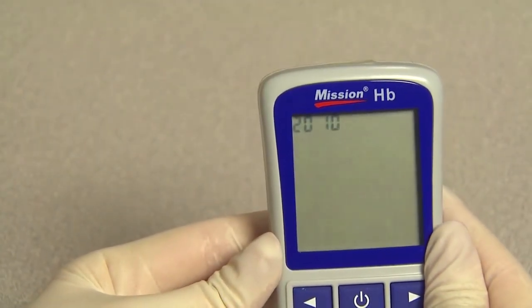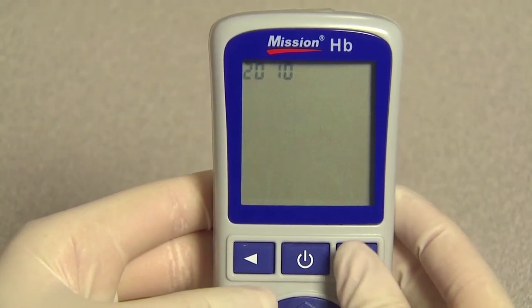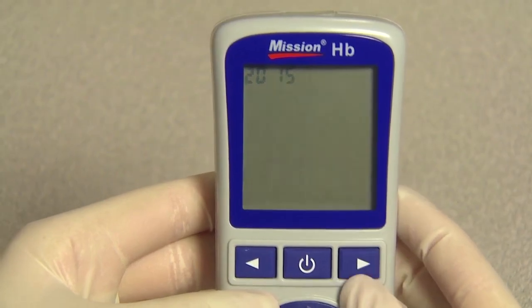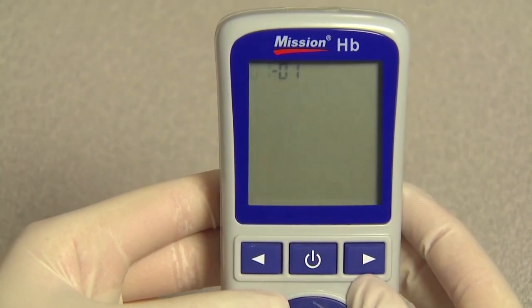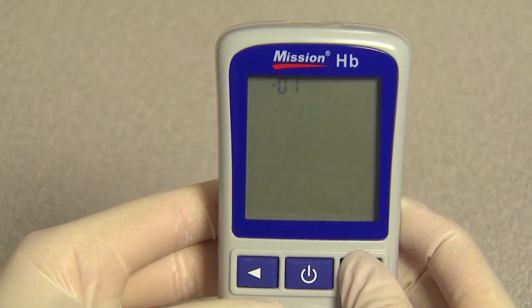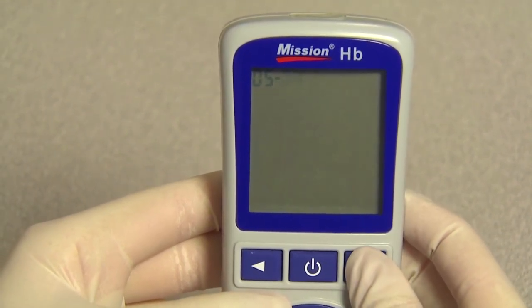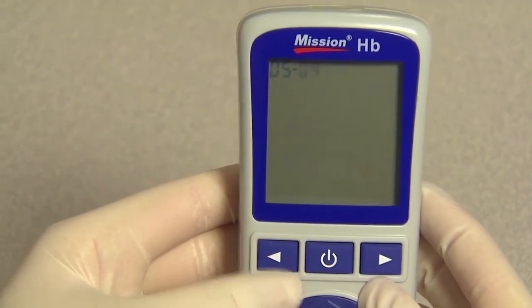The meter will automatically turn on after the batteries are inserted and will enter the time setting state. Press the right or left button to adjust the meter time setting of the year, then press the power button to save. Press right or left to choose the correct month, then press the power button to save. Press right or left to choose the correct date, then press the power button to save.